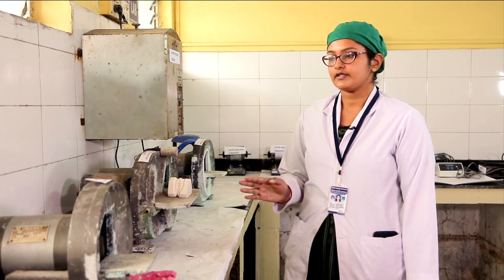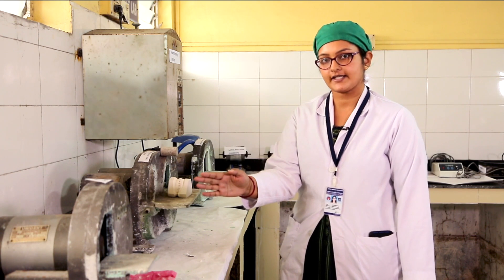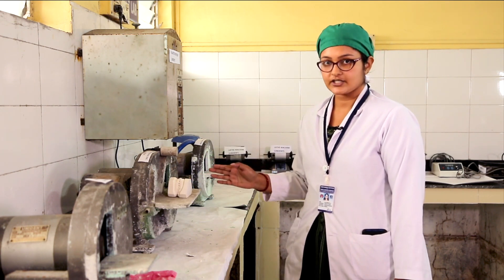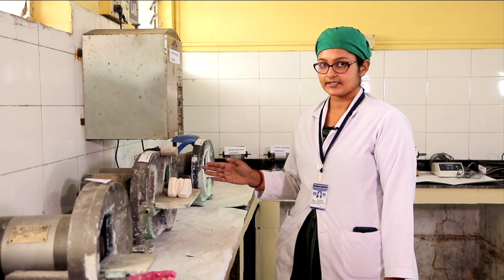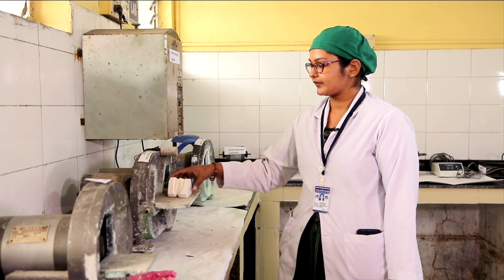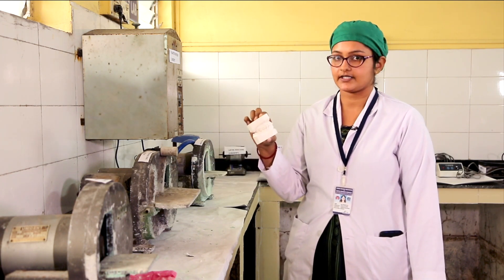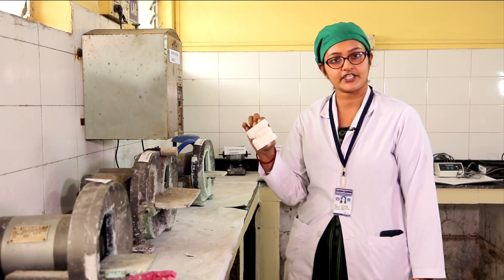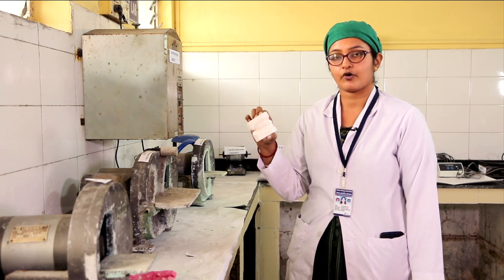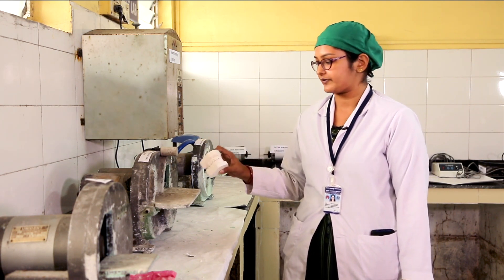These units are called model trimmers. This one is a single disc variety and this one is a double disc variety. The main advantage of the double disc variety is that two people can work at a time on this machine. This is an orthodontic study model, well finished according to international specifications, and it is trimmed with the help of this model trimmer.